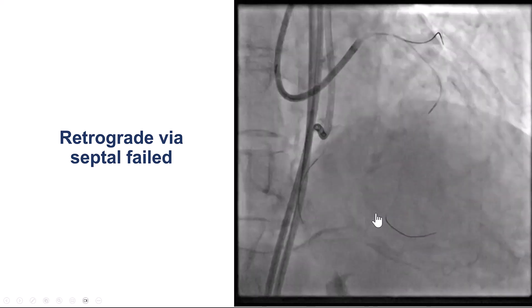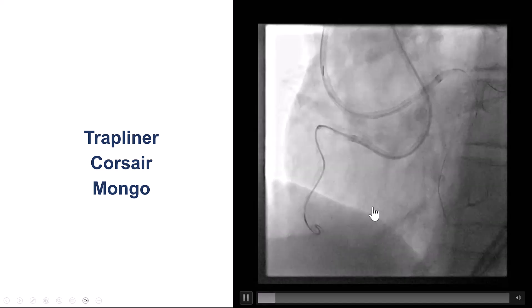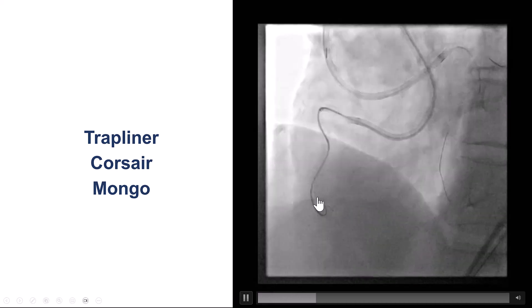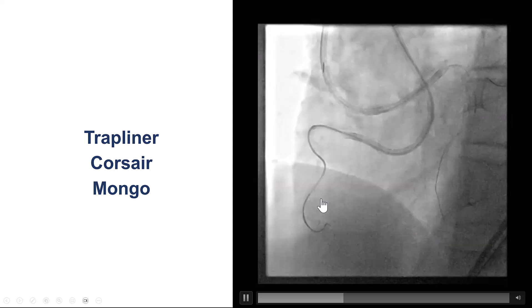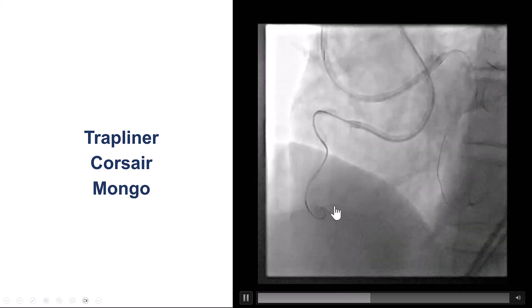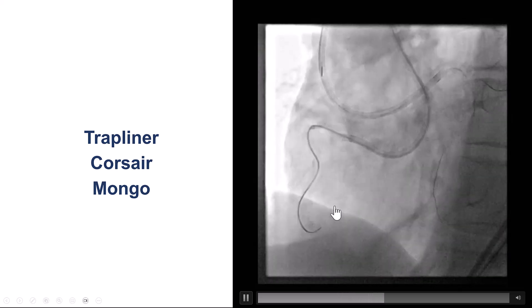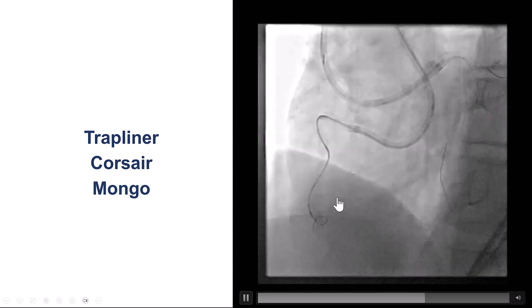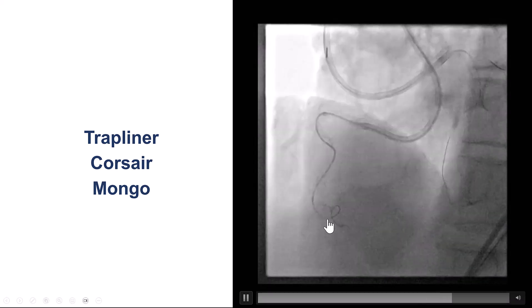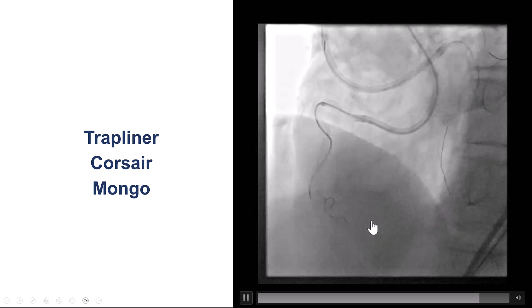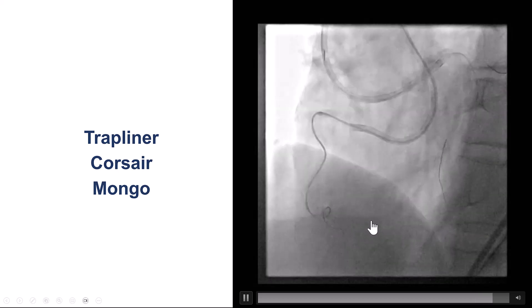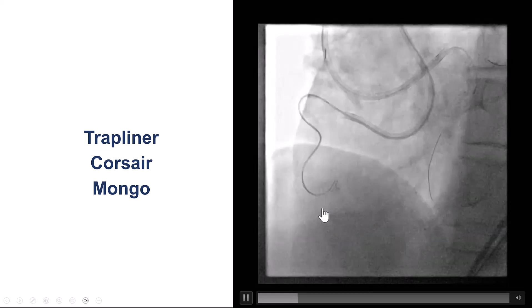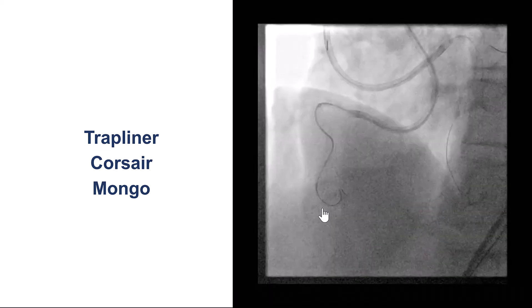As a result, we decided to switch back to the antegrade approach. Using the Corsair catheter as well as a Mongo guidewire — which was difficult to advance — after multiple manipulations, the Mongo took a 360-degree bend and seemed to advance along the course of the vessel. This very extreme 360-degree bend in the distal RCA was partially the problem.